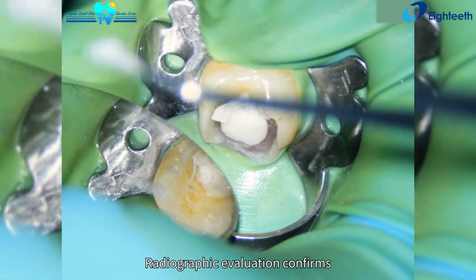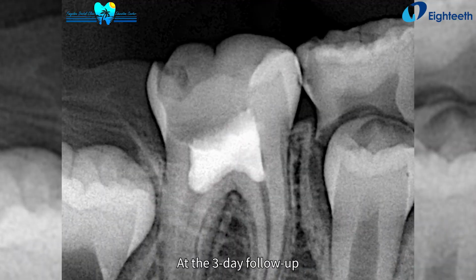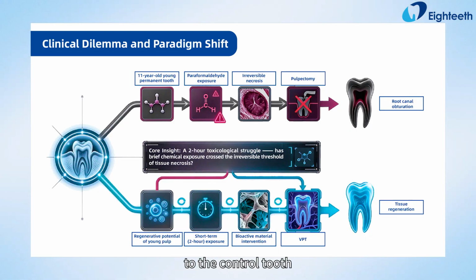Radiographic evaluation confirms a dense and complete seal of the pulp capping material. At the 3-day follow-up, cold testing and EPT responses remain comparable to the control tooth.